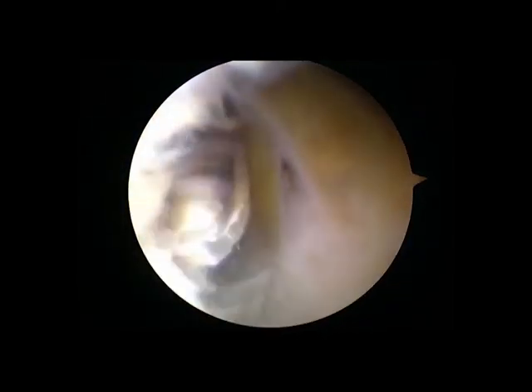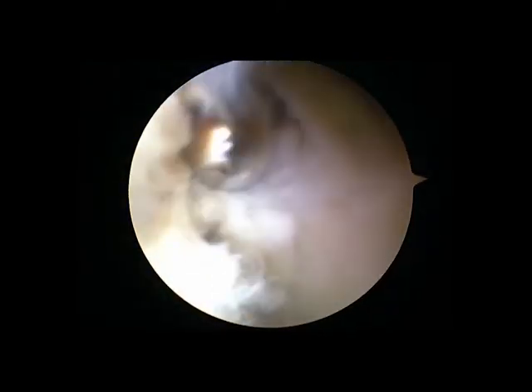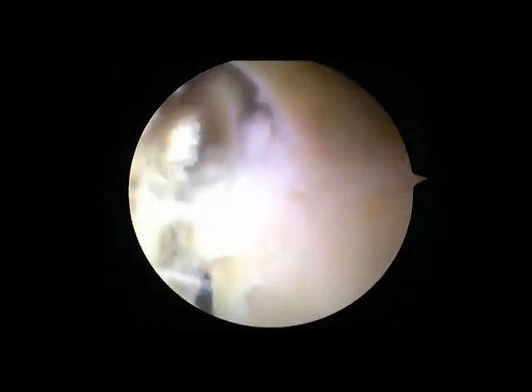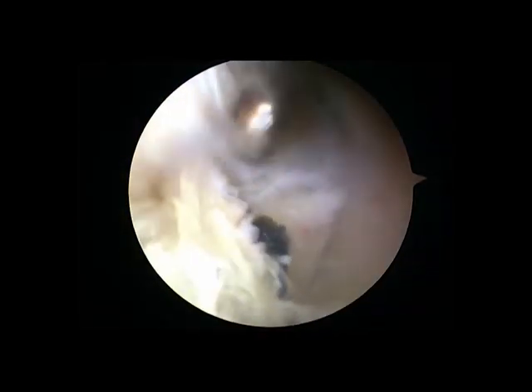After the lesion was identified, the damaged tissue was cleaned by a shaver. Foreign objects in the tissue should be found.